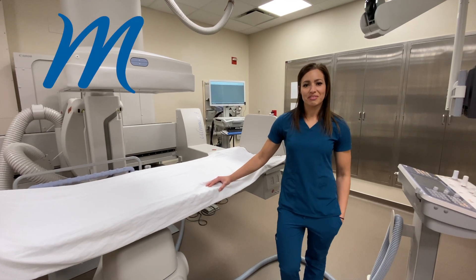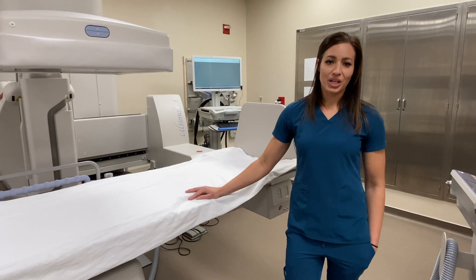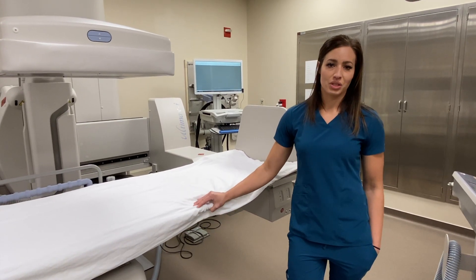Here at Madison Memorial Hospital we are very excited to introduce our Canon Ultimax I, to be able to create better service for our patients and better care for those in our community.